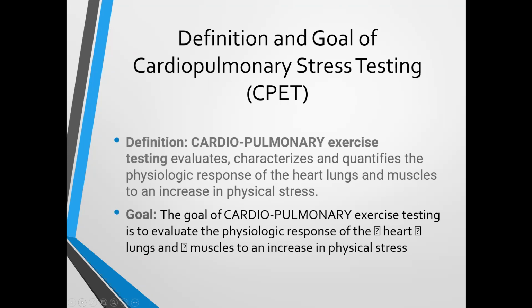Now, the stress we're talking about is not the kind of stress that you experience when you're trying to get to a place fast and you're in traffic. That's a related but different type of stress. The stress we're talking about is what I alluded to earlier, and that is the exercise stress, if you will, the tension on an ergometer or exercise bicycle, the speed and or elevation on a treadmill. So when we talk about physical stress or exercise stress, that's what we're talking about, the load, if you will, the stress load.